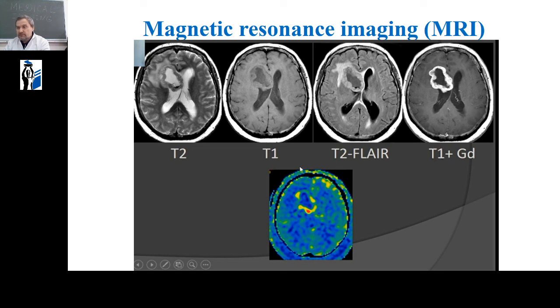Thus, by controlling these modes of magnetic resonance imaging, we achieve a very detailed visualization of the resolution of the soft tissue component in the pathological process.